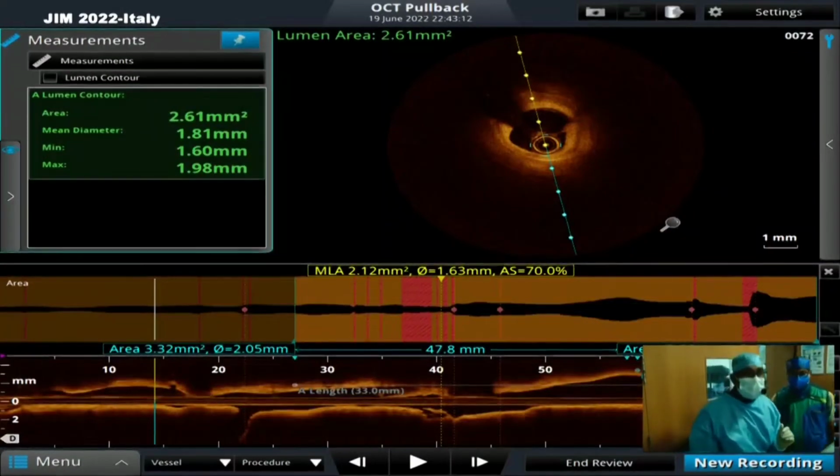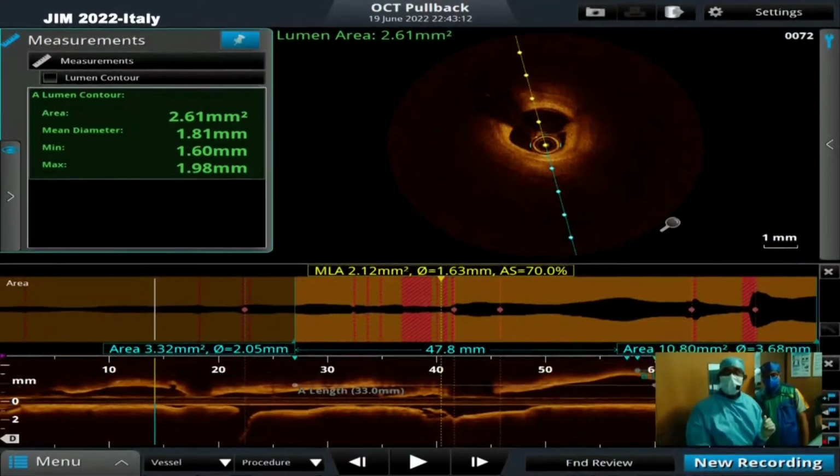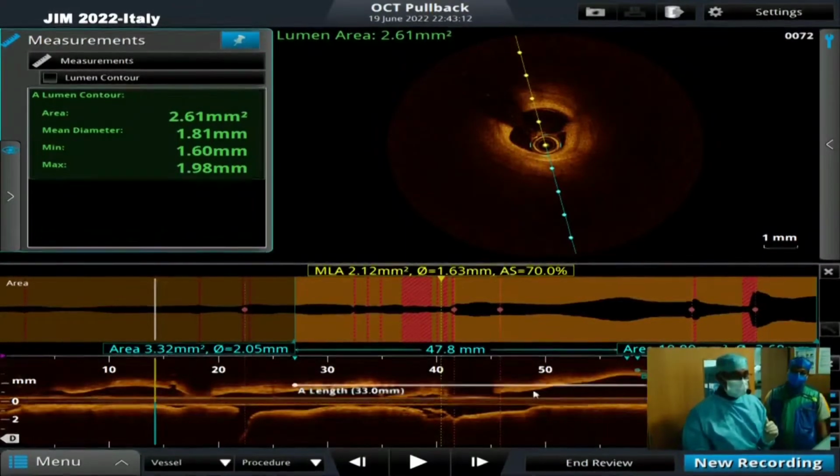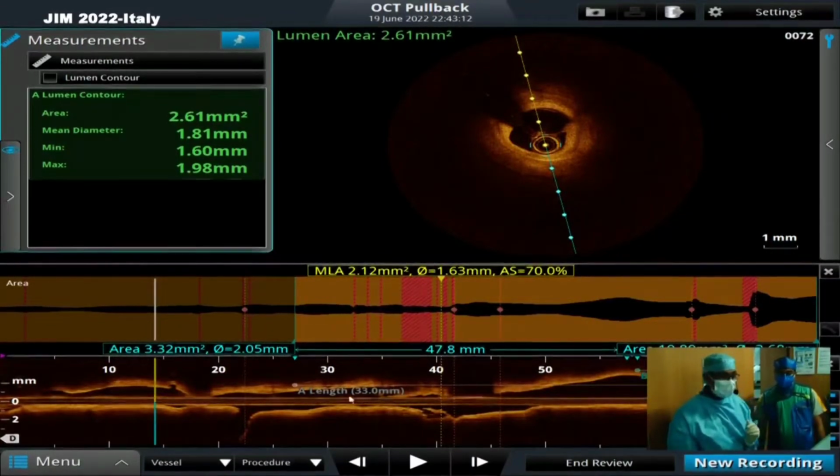Okay, shall I? Great. I would like to see the OCT, and then we can ask again Dr. Selvamani to see which one of those great cases he showed us this one fits the most. Let's go with the OCT.